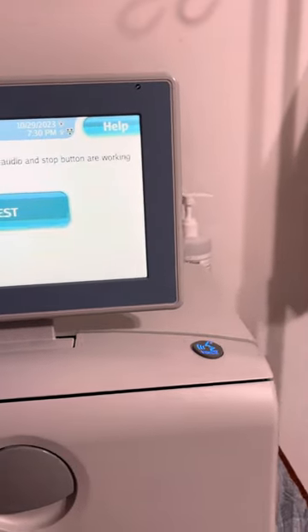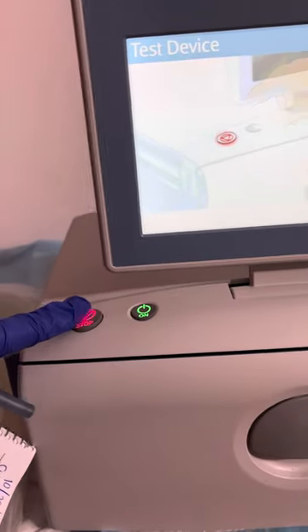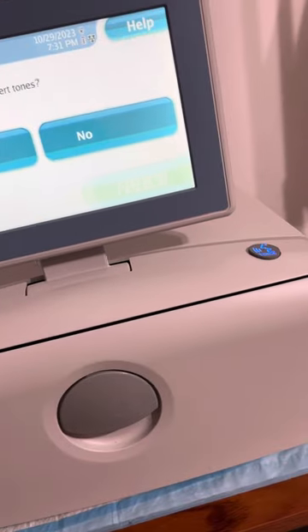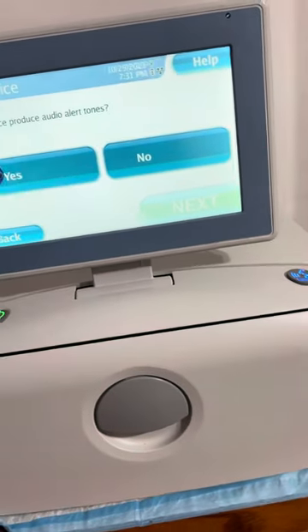So this is how we start for dialysis, peritoneal dialysis. You have to test the machine if it's working or not.